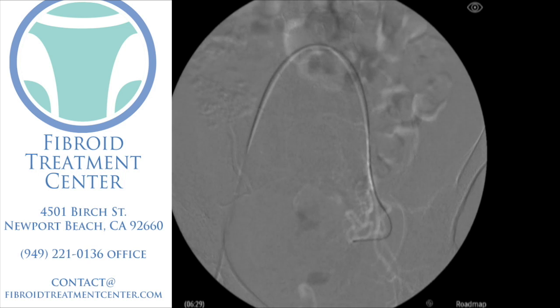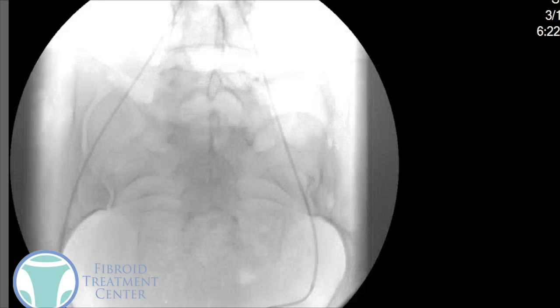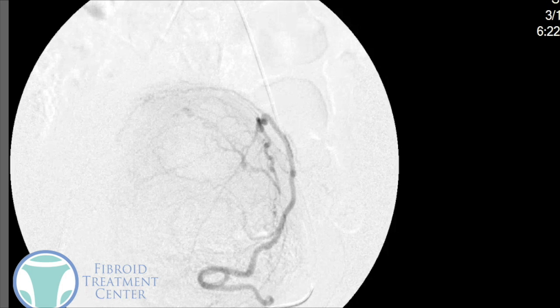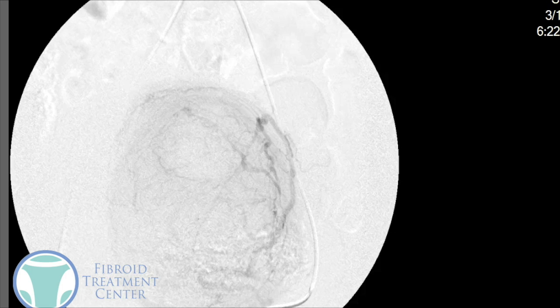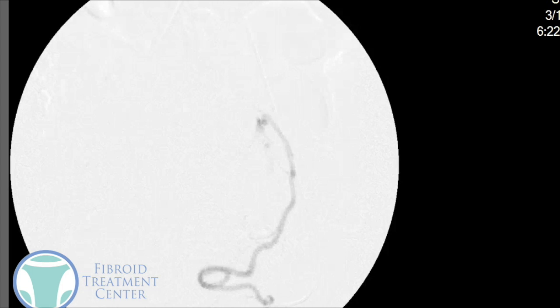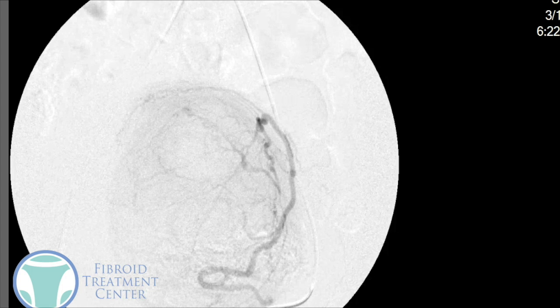We use that little roadmap trick where the arteries are changed into a white line so that we can help navigate the catheter over the wire and into the left uterine artery. Once we've got the catheter secured in place, we take that wire out and do an x-ray from the left side. We inject some contrast, which is a dye, and take x-rays. As you can see, there's that large thick artery and it feeds a large fibroid in the uterus. You can almost make out a sphere or a ball of dark contrast — that's actually the fibroid itself. You can see the large artery going into the fibroid and all the smaller little arteries that feed it, and you can see that spherical nature of the fibroid.